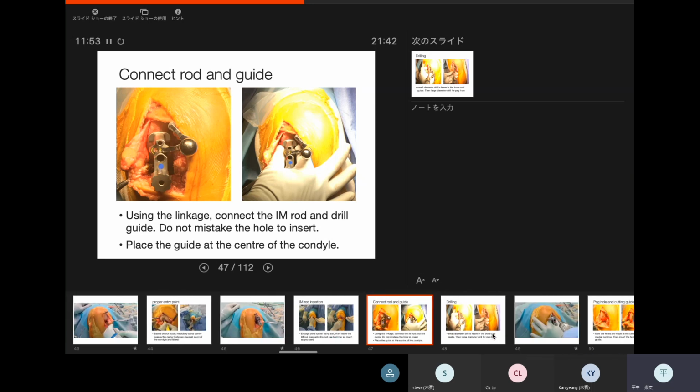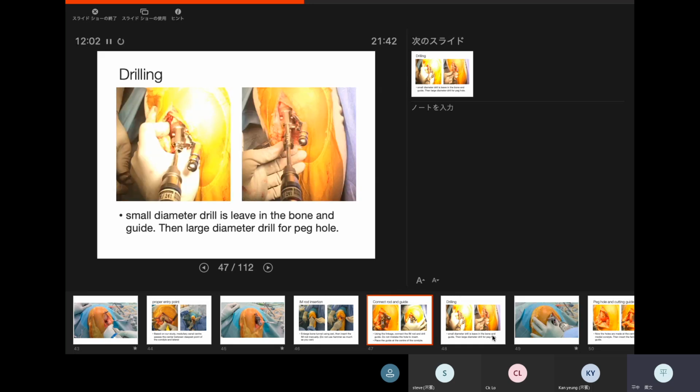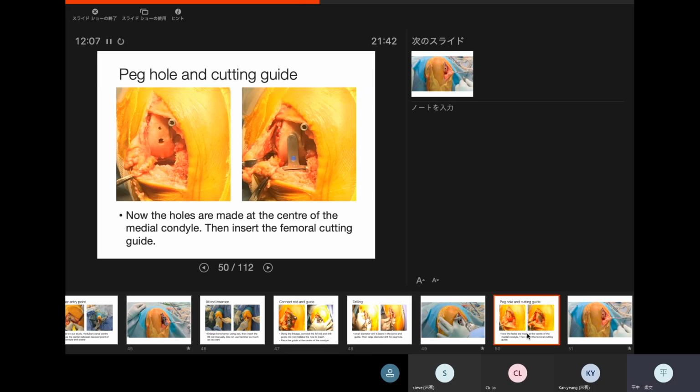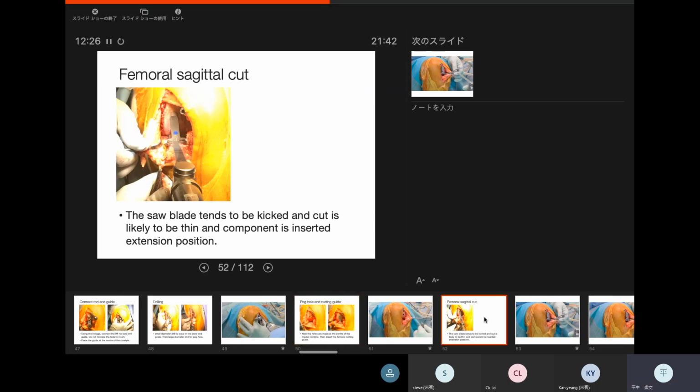At that time, you should pinch the medial femoral condyle using your thumb and index finger. Make the drill hole, and make sure the hole should be made at the center of the medial condyle. Then set the femoral cutting guide and cut.